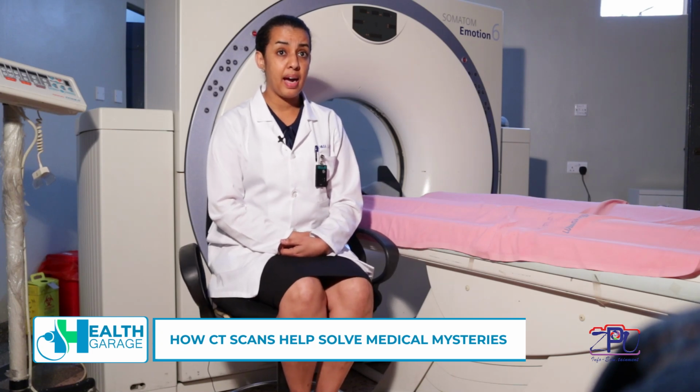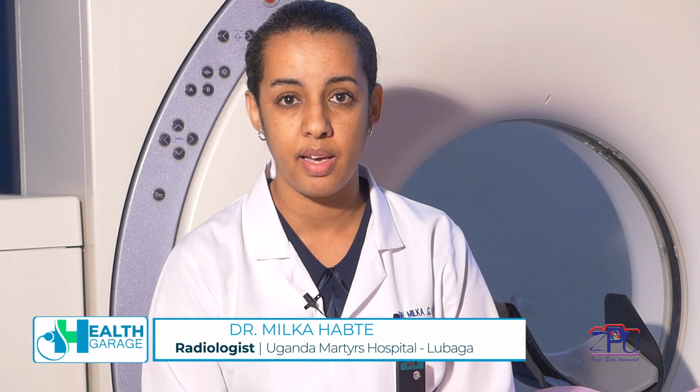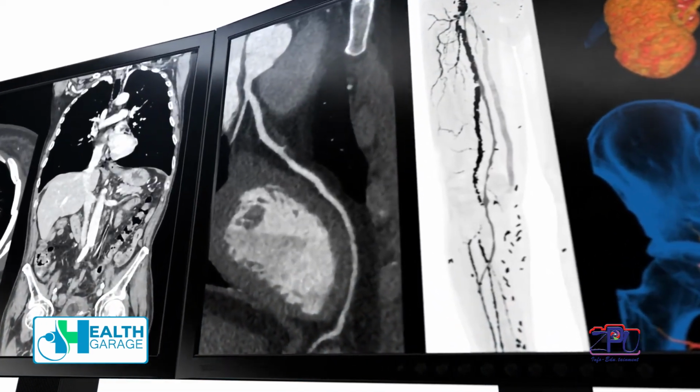CT scans are different depending on the capacity of imaging they do. So we usually look at their slices. The higher the slices a CT scan has, the better resolution, the more accurate the images are, the more precise the images are. And the CT scans that have higher slices help the radiologists and other clinicians to reach accurate and precise diagnosis. So the differences come about depending on what the different CT scanners are able to perform. Commonly, as I mentioned earlier, we use X-rays and a computer system to generate CT images.